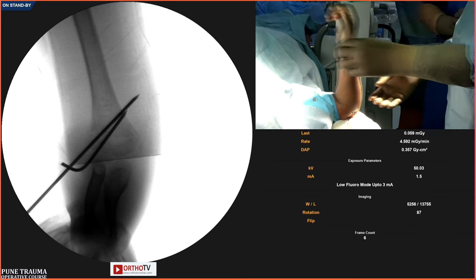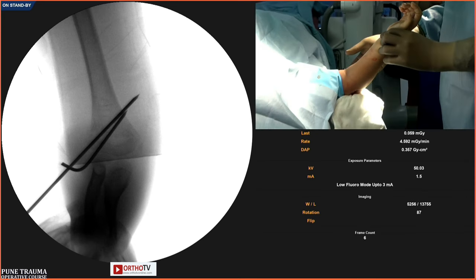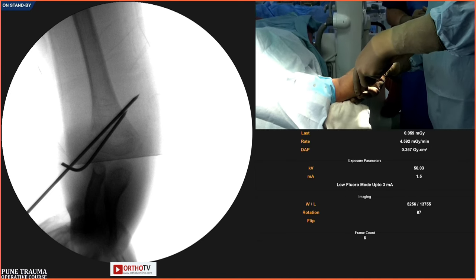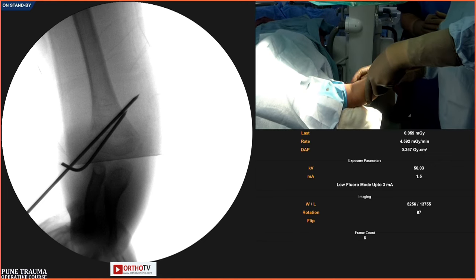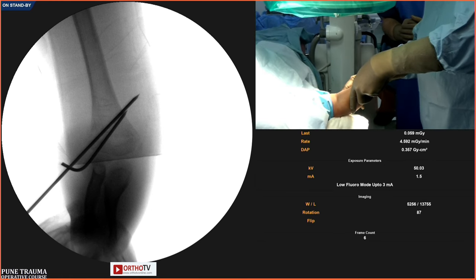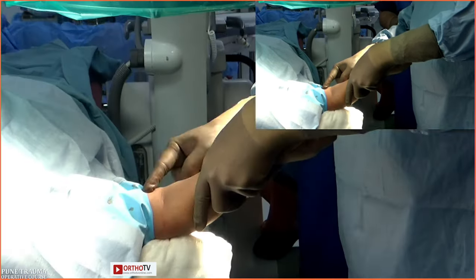Right. After which you will extend the elbow. When you extend the elbow, the ulnar nerve, palpate your own ulnar nerve, will fall backwards. And then with your finger palpation, I will palpate the medial epicondyle. And with a hand, like I said, the K-wire in the hand, you will just place the K-wire on the epicondyle anteromedially, and your direction has to be anteromedial to posterolateral for the medial pin.